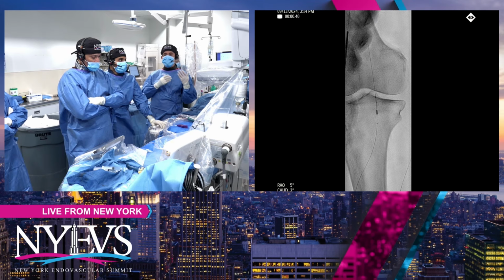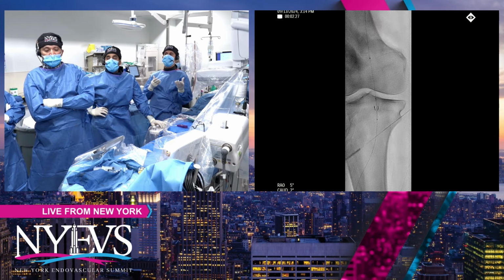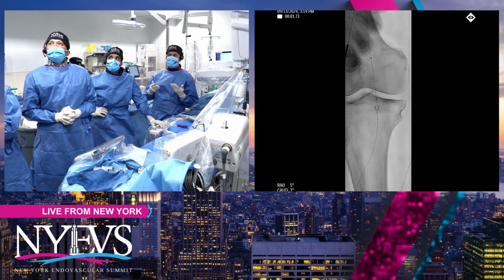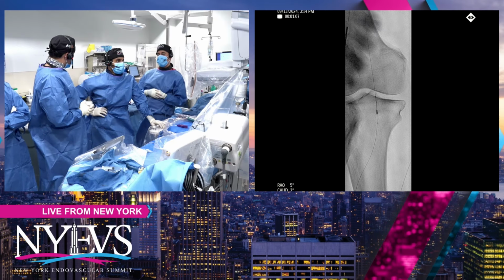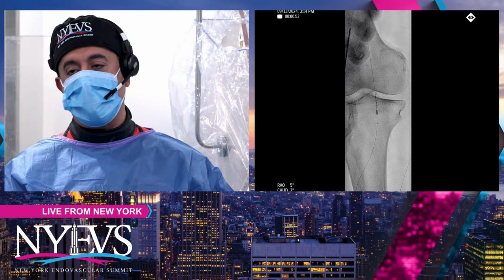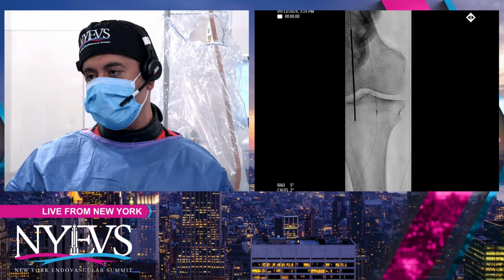And in order to visualize with a 7 French or an 8 French device in, we had to have a little bit more lumen so we can visualize at the same time we are working. So that's why we chose an 8 French system. I know it sounds a little bit aggressive, but in this case, 8 French was definitely warranted. We had a discussion between the three of us, and also the groin was not bad on the left side, the access side, so that made our decision easier of doing an 8 French.